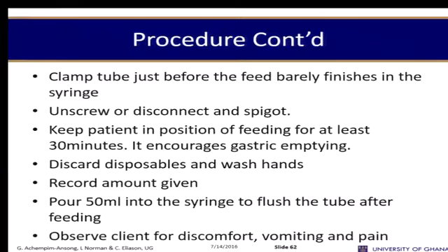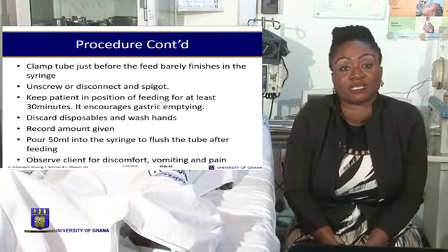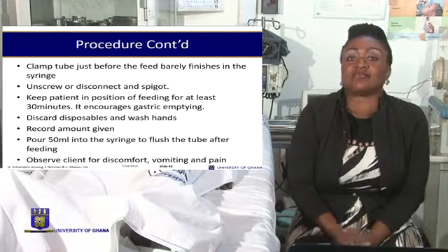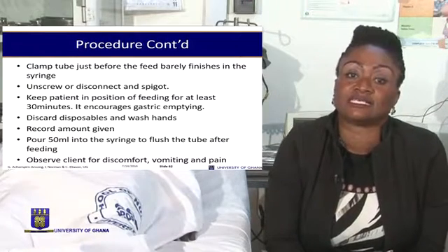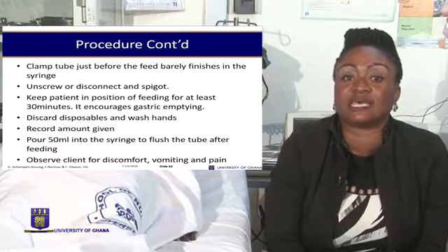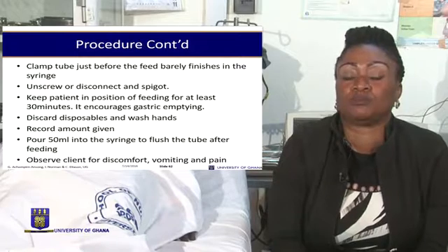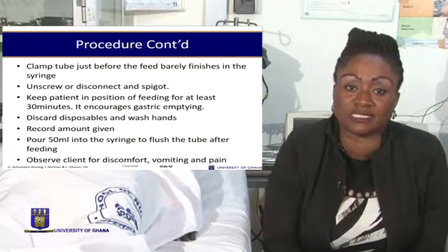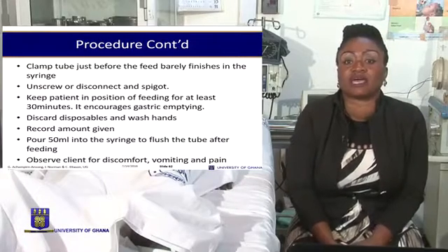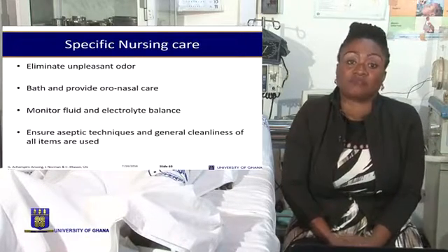It is unscrewed and disconnected and spigoted, and then the patient is kept in the position of feeding for at least 30 minutes, and this encourages gastric emptying. Then the tray is discarded, wash hands, and then we record the amount of feed. This should be recorded both in the nurse's notes and the intake and output charts. Observe the client for discomfort, vomiting, and pain after the feeding.